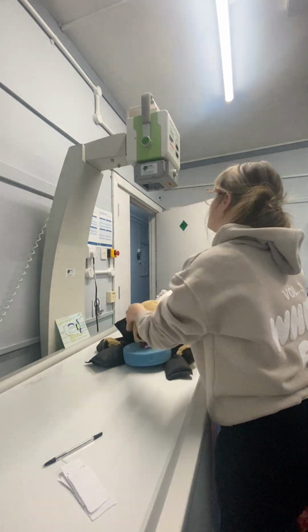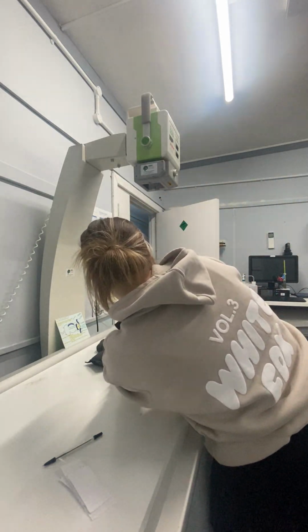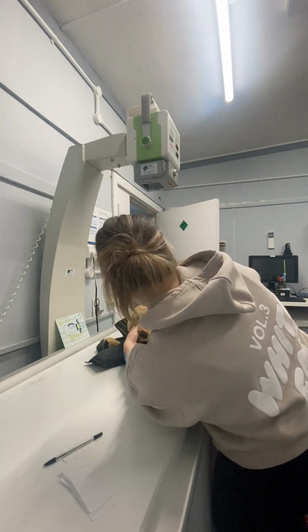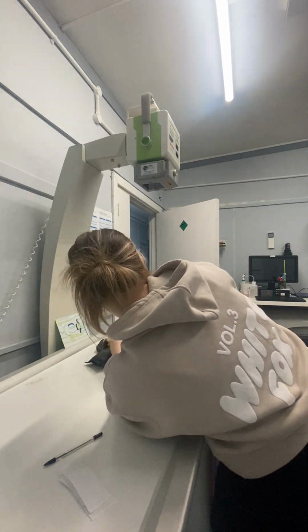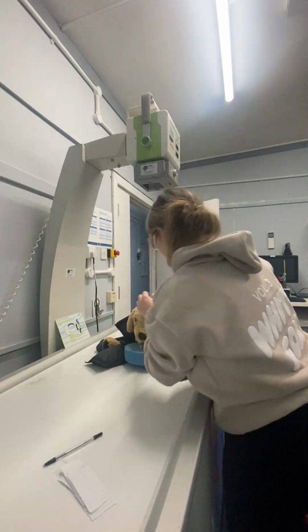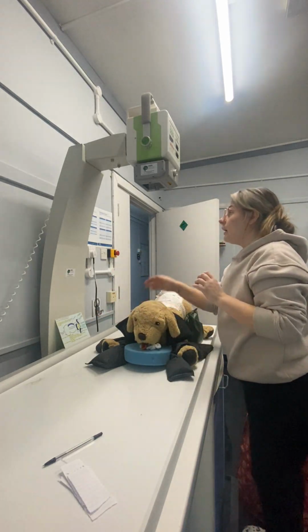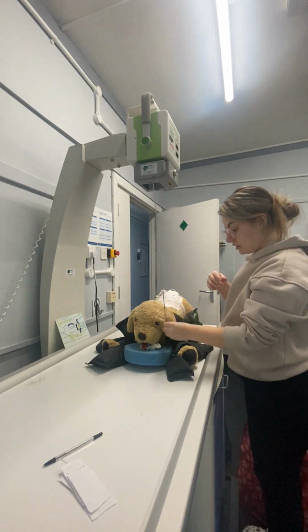I'm going to just make sure that we're all symmetrical, and I can use the nares and the sagittal crest as a guide. So just looking down the patient like that. That looks okay. And making sure the limbs are extended as well. And then I'm just going to measure the depth of the patient.